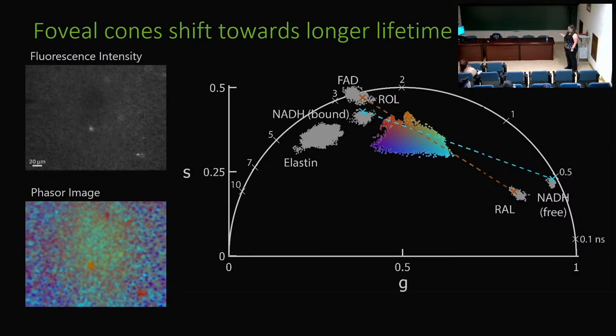We then moved from the peripheral regions where we were looking, where we have the nice large cones and the small rods, into a fovea. Unfortunately, we only do one image at each location. We don't go back and repeat the images just to ensure that there's no later effects. And so we get one shot in each monkey. So we have very little data in the fovea, but we're really excited to get this bit here. This is the first time we'd imaged this fovea, and you can see the intensity image, not as sharp as some of the others.